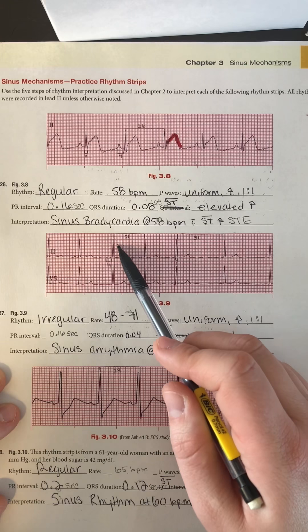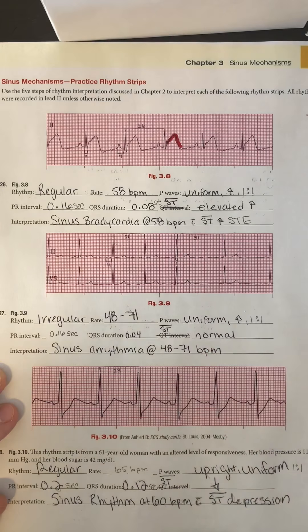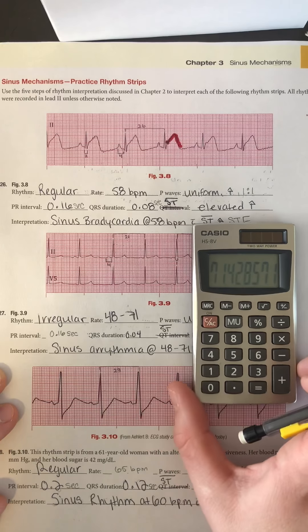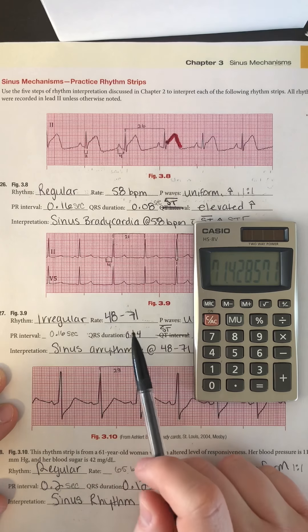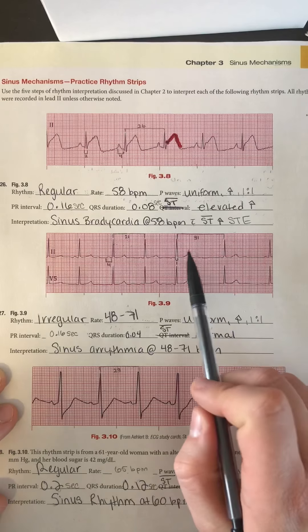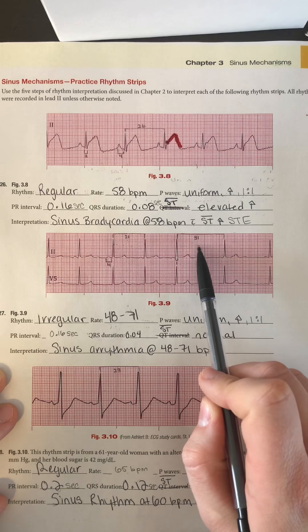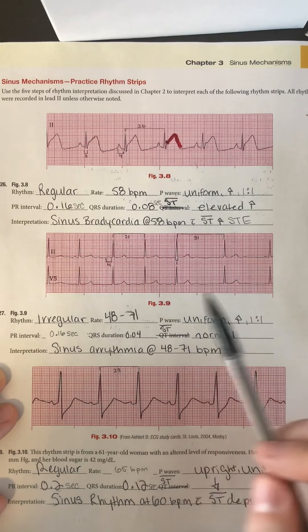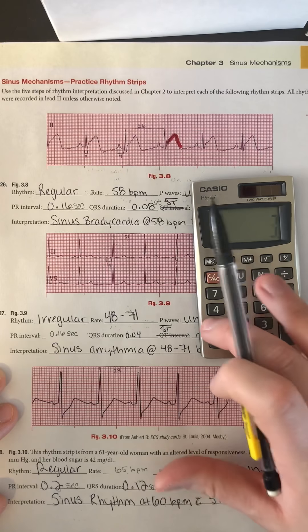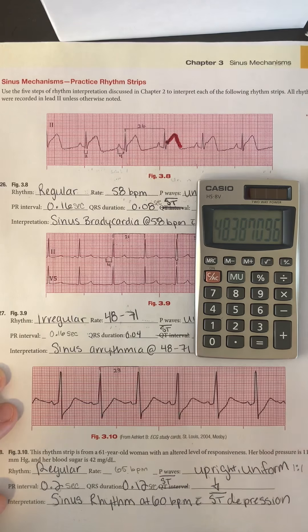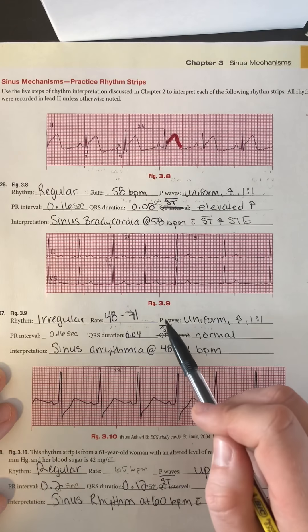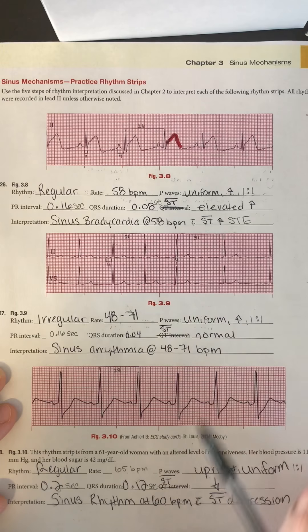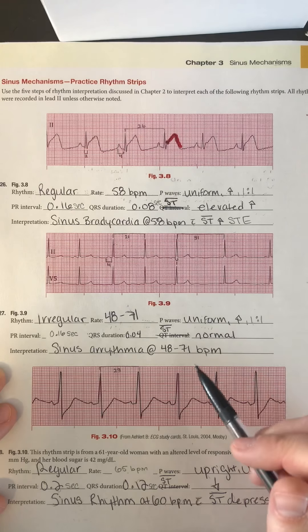I found the two closest QRS complexes, which lined up with a block: 5, 10, 15, 20, 21 — giving me 21 blocks, for a top rate of 71 beats per minute. Then for the widest interval I counted 5, 10, 15, 20, 25, 26, 27, 28, 29, 30, 31 — 1500 divided by 31 gives the low end of 48 beats per minute. Looking at the P waves, they're small but I have one P wave for every QRS complex. They are upright, all look similar, and the conduction ratio is one to one.